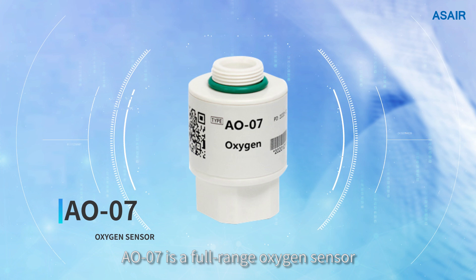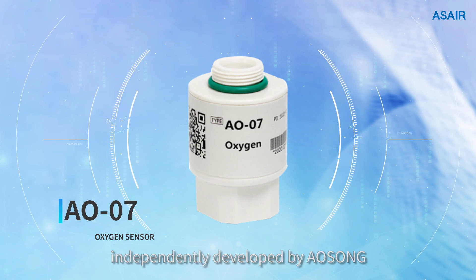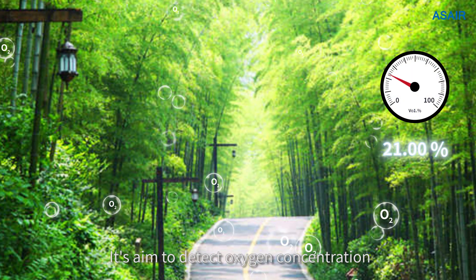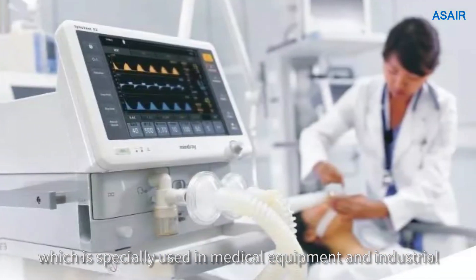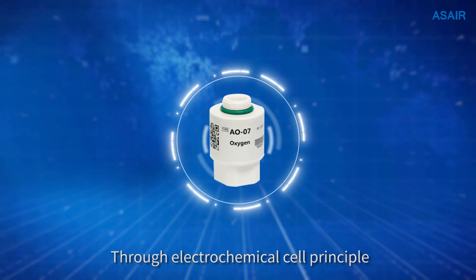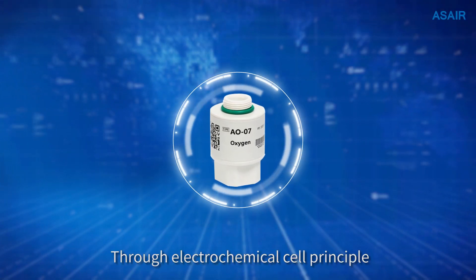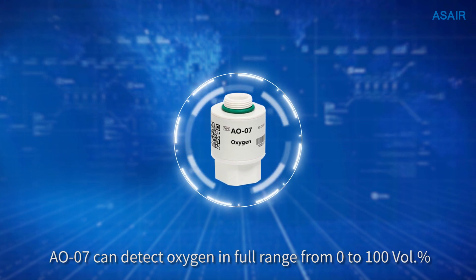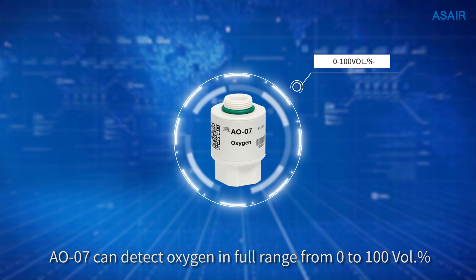AO07 is a full-range oxygen sensor independently developed by Osun. It is aimed to detect oxygen concentration, which is specially used in medical equipment and industry. Through the electrochemical cell principle, AO07 can detect oxygen in full range from 0 to 100 volume percent.